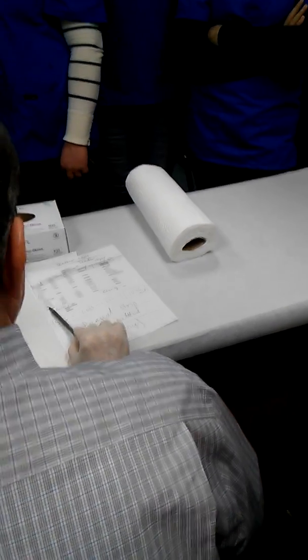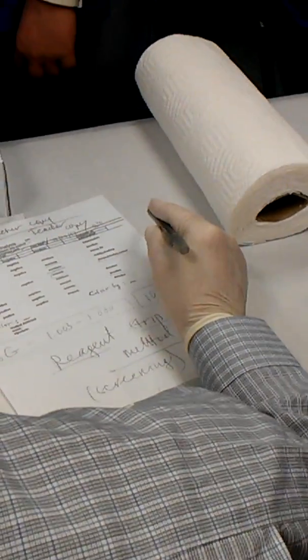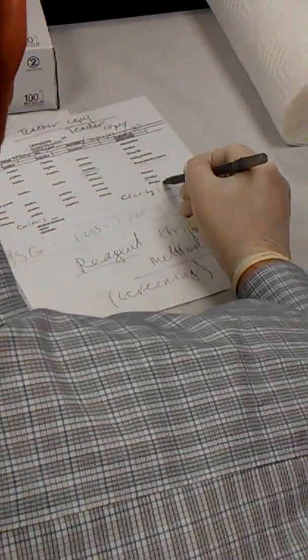What is bilirubin? I told you, jaundice, right? Jaundice is желтуха, yellow discoloration of the skin and mucous membrane. And finally, sugar. When we detect the sugar, people have diabetes, correct? Diabetes mellitus. So what are you doing and how are you doing this? Okay, so let's start. I took the strip, right?